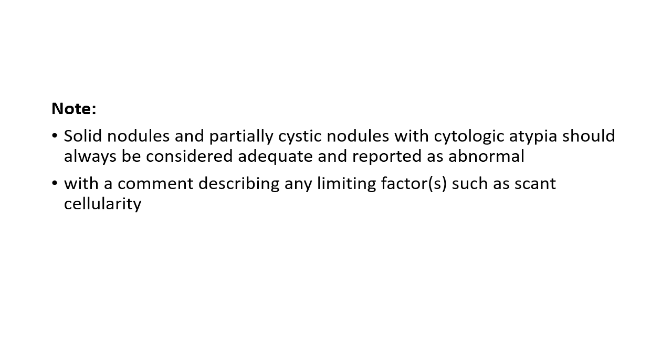So there's a note that solid nodules and partially cystic nodules with cytologic atypia should always be considered adequate, and they should be reported as abnormal, with a comment describing any limiting factors such as scant cellularity. This we have already discussed before.